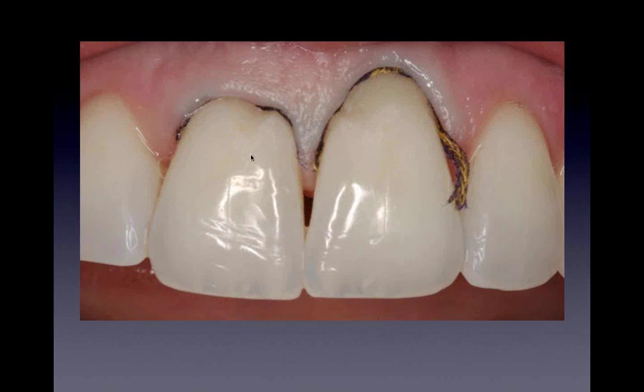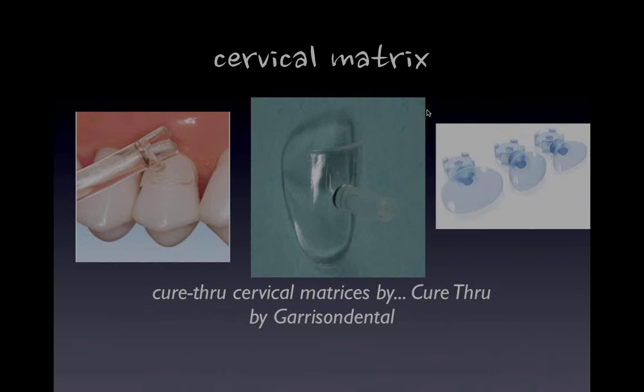So we'll go ahead and again scratch the semilunar, scratch the enamel semilunar there, because remember dentin bond is not that strong as enamel bond, so we want to get a little bit of the enamel bond working to our benefit here. And again, some people like to make an actual margin. For these types of small repairs, it's basically a feather edge. When I go around on the lingual, you'll see a lot of them have a certain butt joint because I need support for the occlusion. But here, I just want to grab a little bit of the enamel to help you get a good enamel bond.